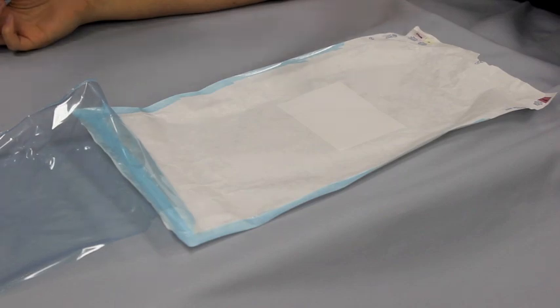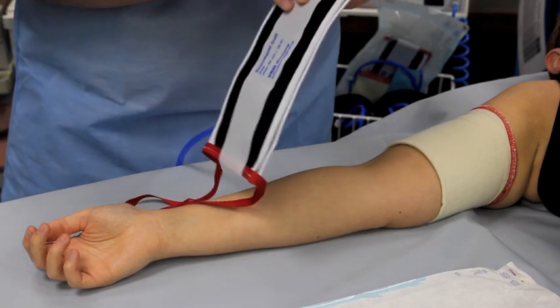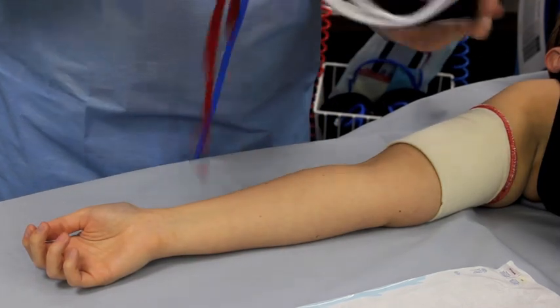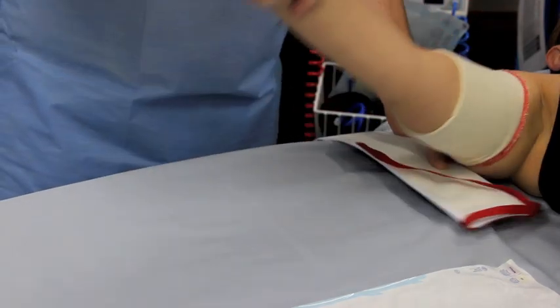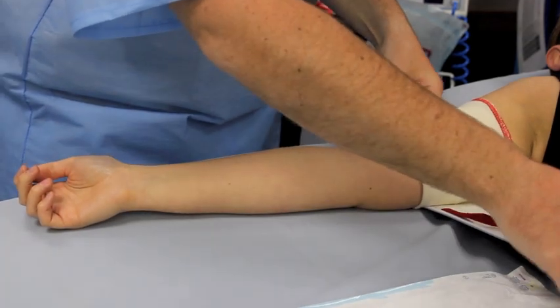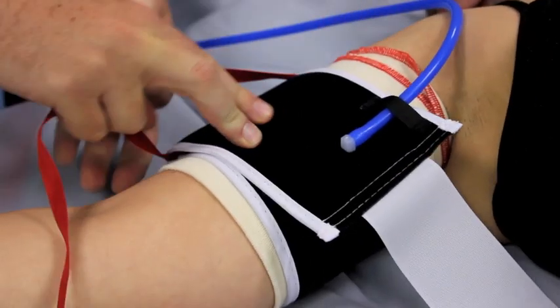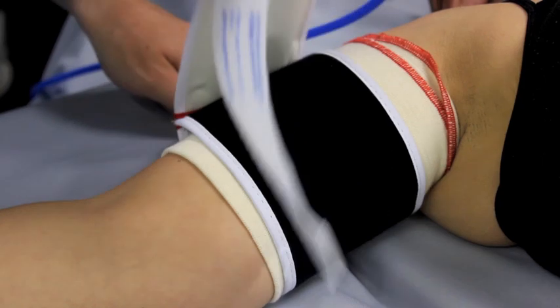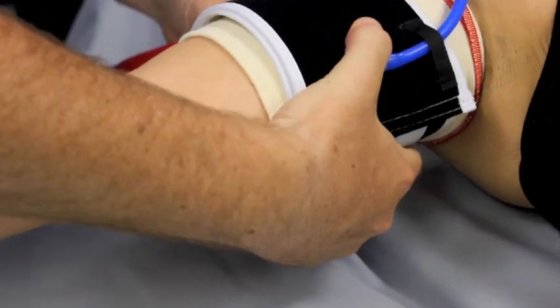By selecting the correct tourniquet size, application of the cuff is much easier. Too long a cuff creates excessive overlap, causing a loose fitting cuff and insufficient occlusion. The bladder must overlap but not exceed one quarter to one third of the overall cuff length. By using the colour coded ties, the tourniquet cuff can be tightened sufficiently reducing movement of the cuff during inflation.